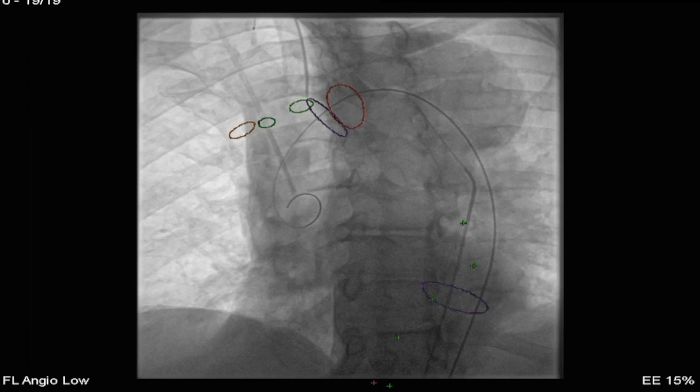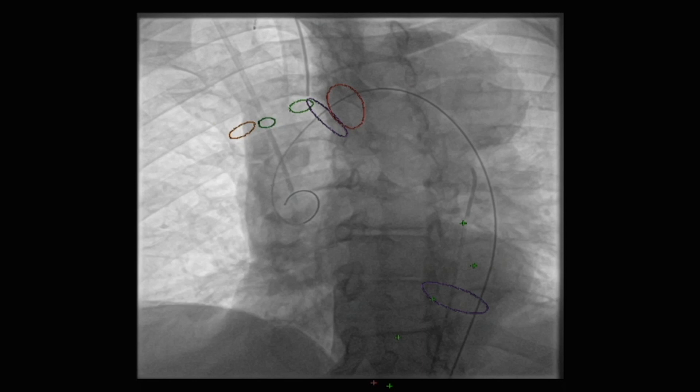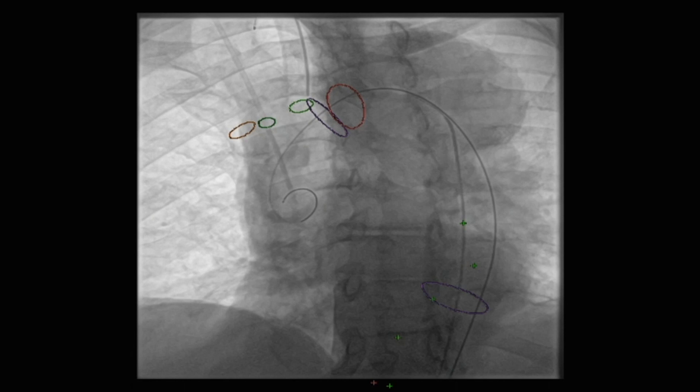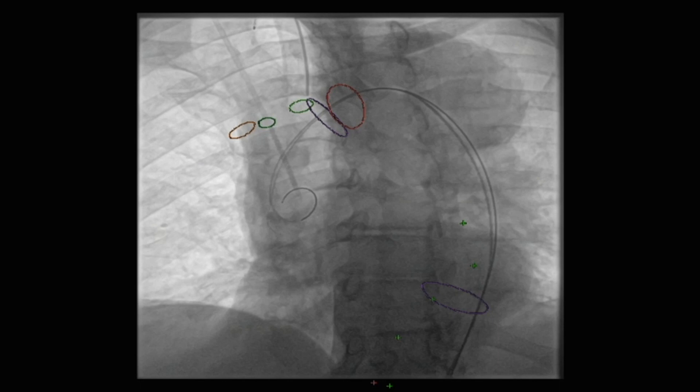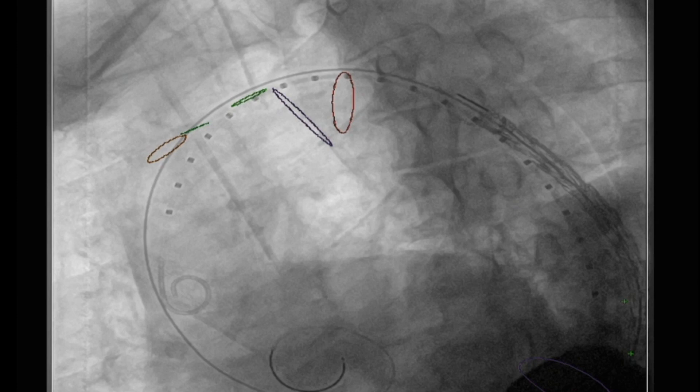What you'll now see is the angiogram being performed and showing the accuracy of fusion. Sometimes you've got to actually adjust these because if there are devices in there, it can cause some deformity. So it's important to validate these. There's not a lot of deformity where it actually occurs in the aortic arch, and so you'll see the fidelity of these markers as they're being placed. The green plus signs are where we mark the intercostal arteries, and that's used to try and spare intercostals as much as possible.